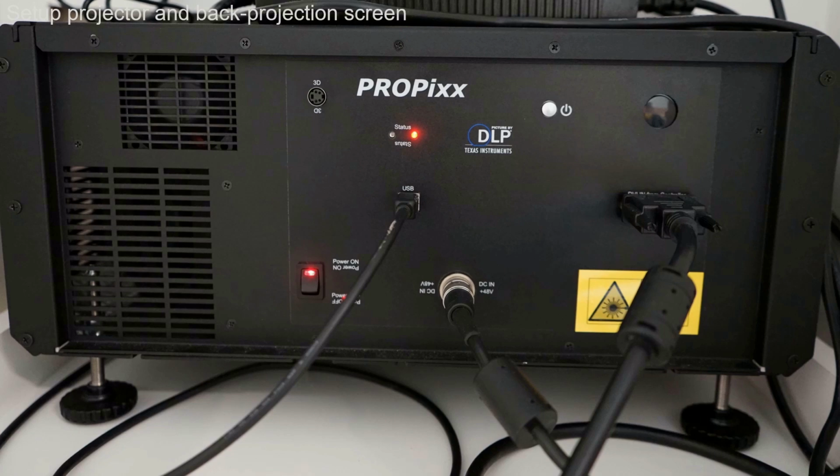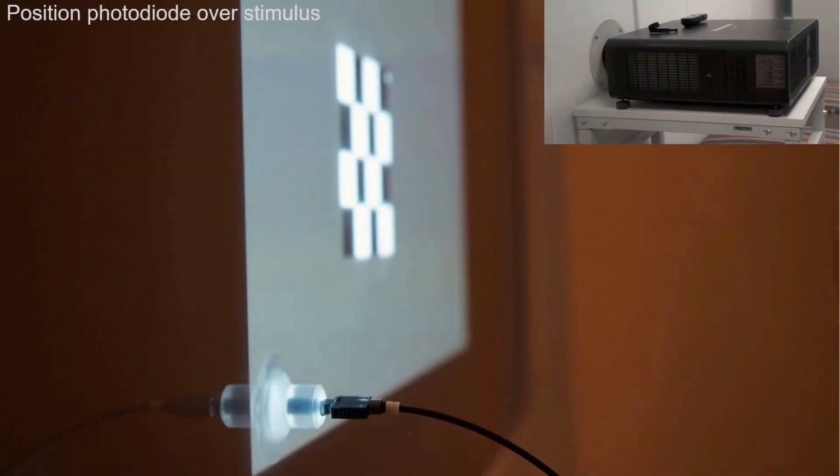If the system has a ProPix projector with the option to trigger from pixel changes, the pixel triggering will automatically provide correct timing of the stimulus. Please consult the audiovisual stimulus system instructions for use for details. With other projectors provided with your system, it may be necessary to apply a photodiode for ensuring the correct stimulus trigger timing. Position and attach the photodiode over the white square in the lower left corner.